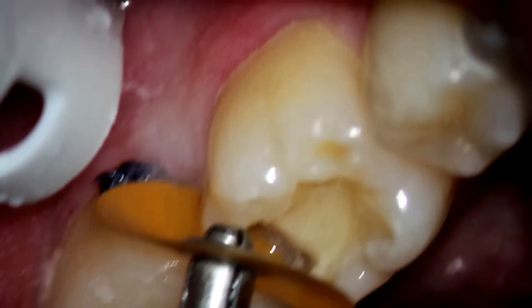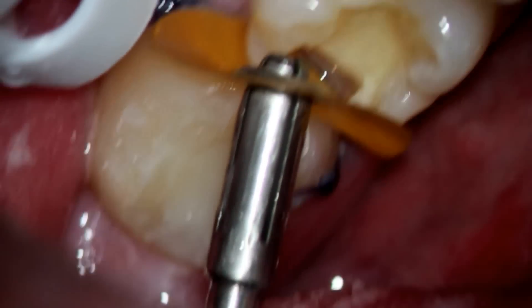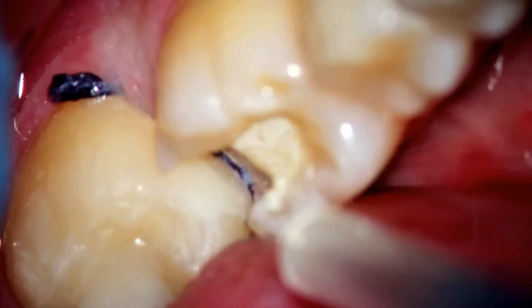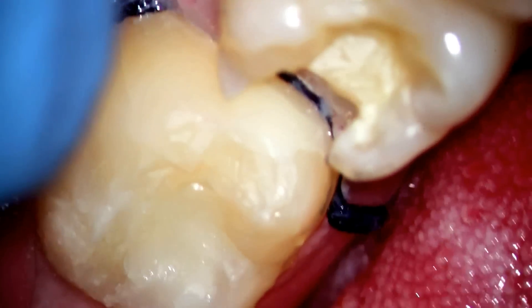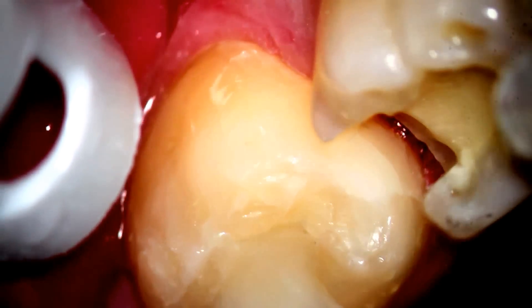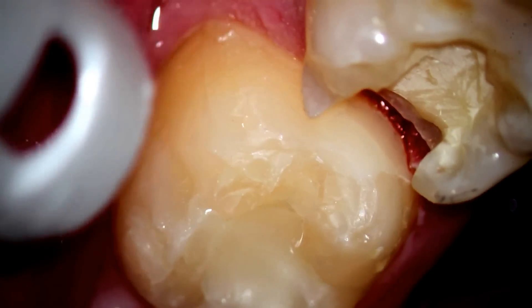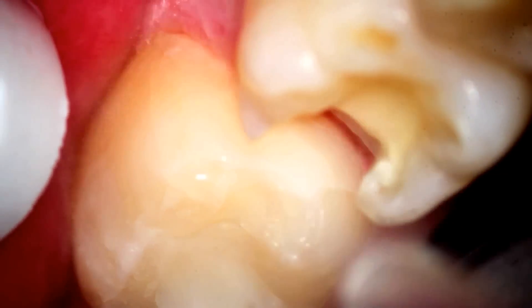There are folks who really like to say to use a rubber dam in a situation like that. I've found that with a microscope, over 30 years I haven't had problems with leakage where I've had to go back and redo things. Here I am polishing the interproximal area with a soft flex disc just to make sure everything is nice and polished. Notice it's not bleeding after that — that's because of the cord that was there — and I was able to make it really quite nice, with just a little bit of oozing.